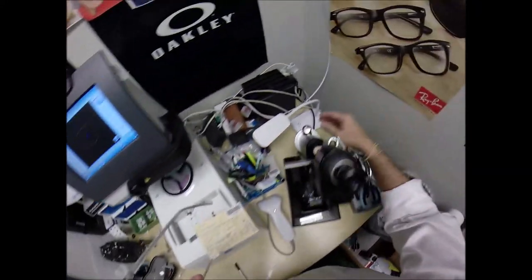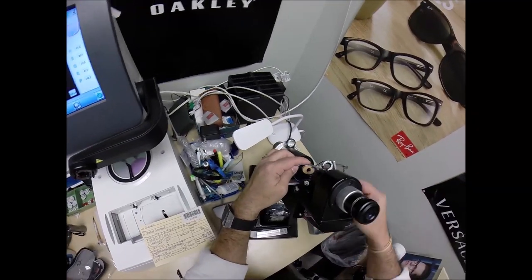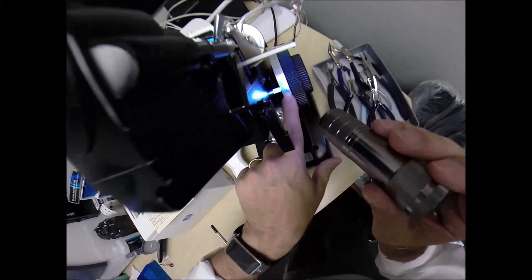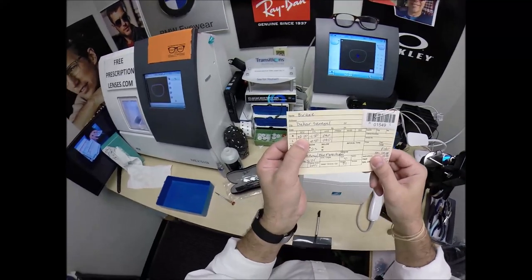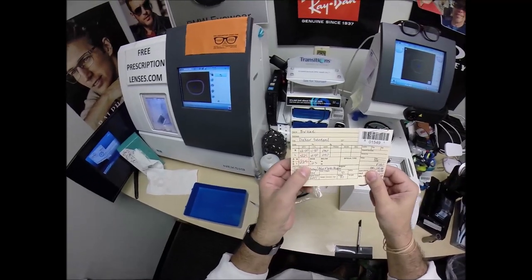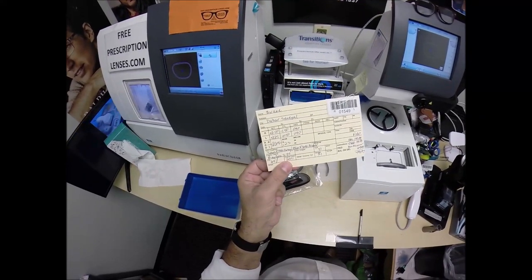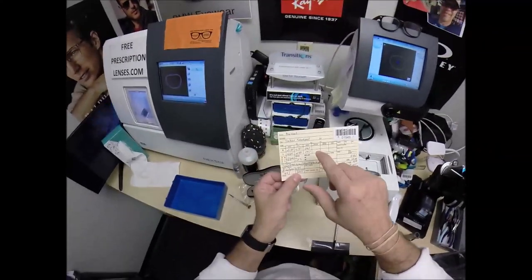We're going to come down here to the lensometer, spin the axis wheel to 90, and put it in over that black dot and read the power. First we've got to turn it on — that old trick. We're getting plus 250, exactly halfway between two and three. That's because your power for the right eye is plus 250, so you are farsighted.